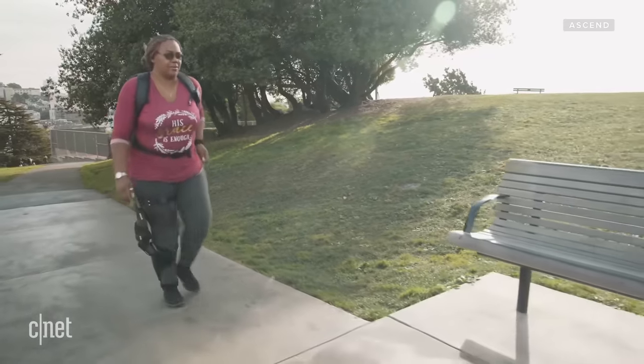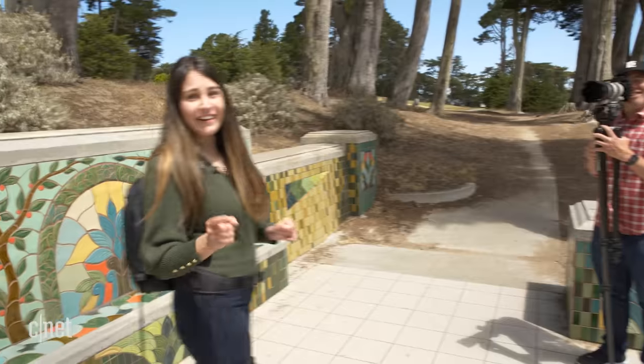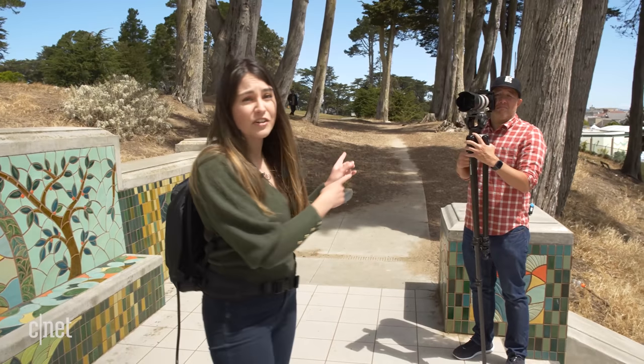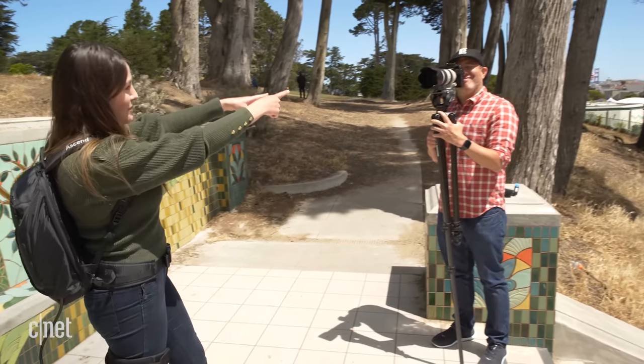Lucky for you, Mitch — who has experienced knee pain and who is filming at the moment — is going to put on the Ascend. Because it's all well and good that I tell you about this as someone who doesn't experience knee pain, but someone with knee pain is actually going to give you the lowdown. So Mitch, you're on the spot — I'm going to put it on you right now.